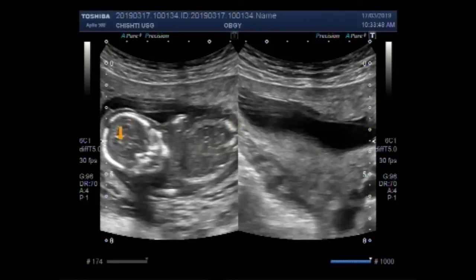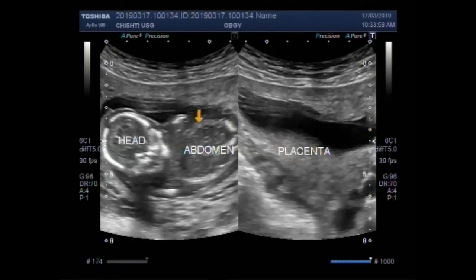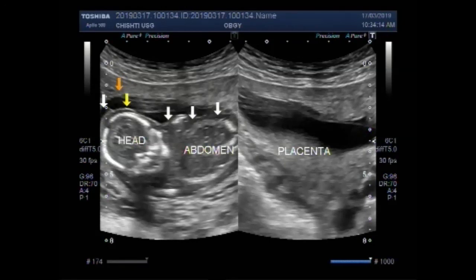This is the fetal head, this is the fetal abdominal cavity, and this is the placenta posteriorly attached. This is soft tissue edema around the fetal head and fetal abdomen.